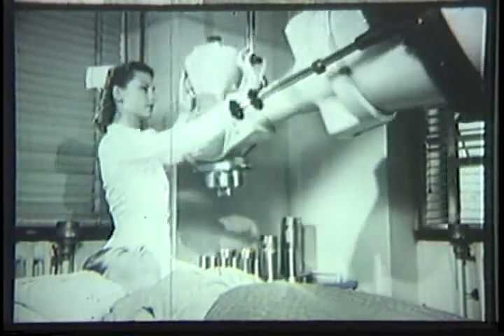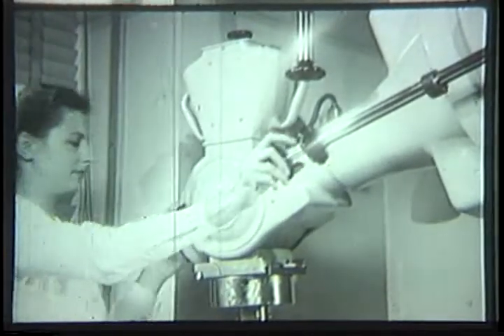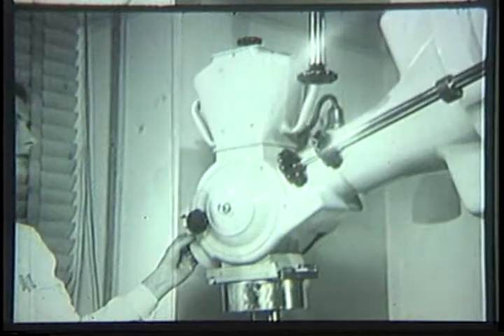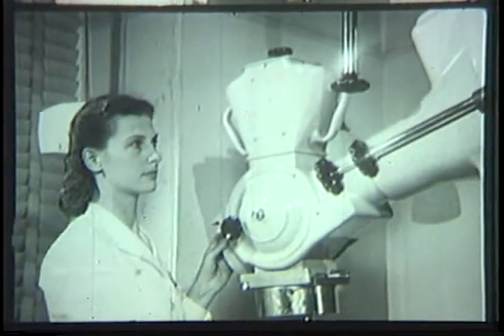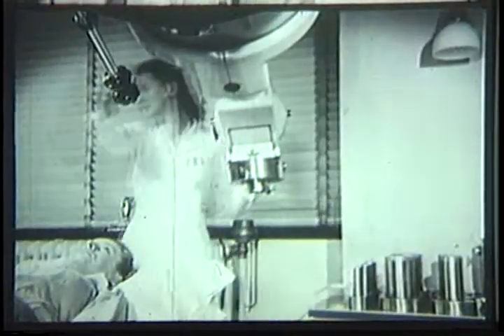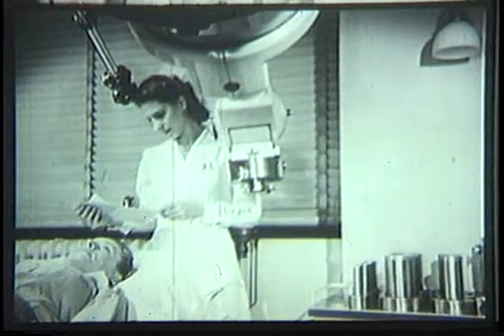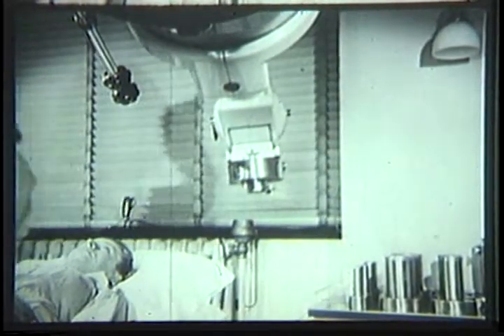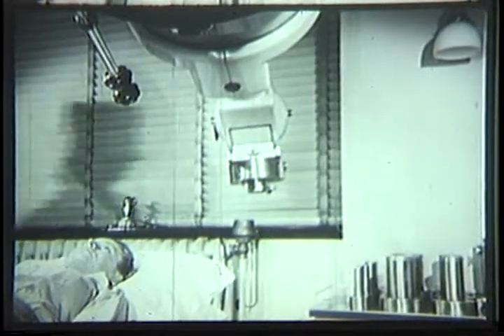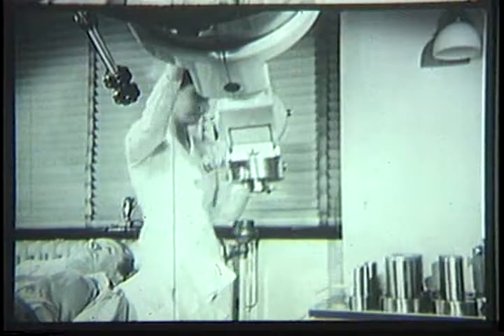Then the nurse technician quickly swings the X-ray machine into position and tightens the adjustment levers. And now the head is turned so the rays will be aimed correctly.